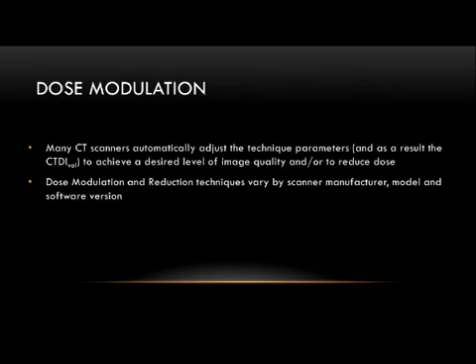What we're going to focus on here with AEC is really tube current modulation, or dose modulation, and scanners are able to adjust the tube current to achieve the desired image quality or to reduce or increase dose compared to a standard reference for individual patients.